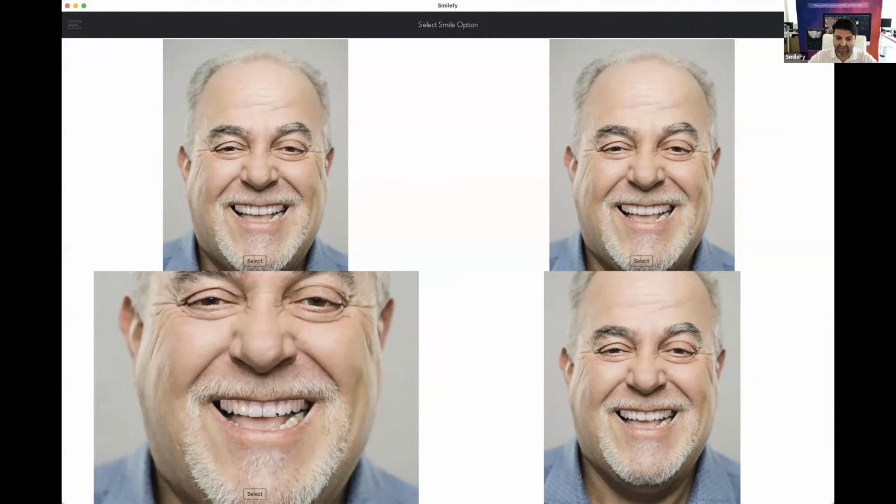Because number one, 2D smile design 10 years ago was a very genius idea, and it was the only way to motivate the patient and to create something that shows the patient the advantage of an aesthetic treatment. If we try to find something clinical in the 2D design, we do have a lot of limitations, because number one, the position of the face of the patient is not always perfectly frontal to the camera.